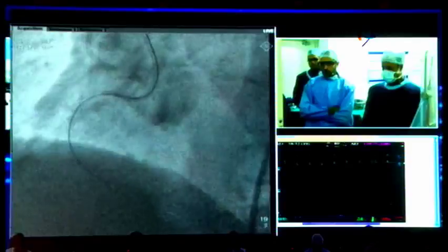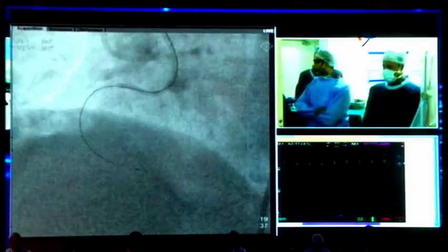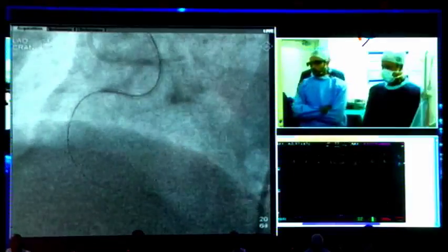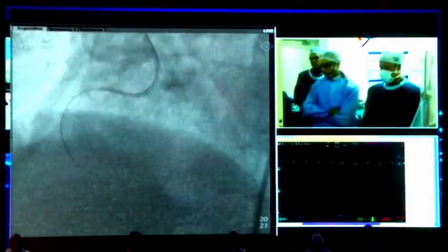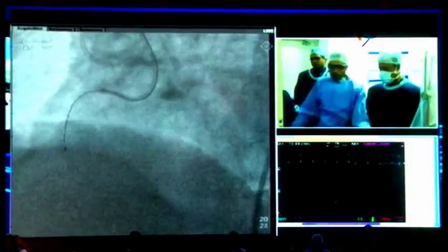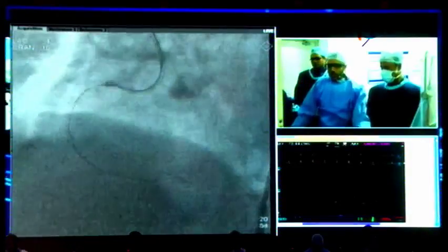Okay. Is that where we are? Is that the last fluoro? Okay, good. So that's where we are. Now we're going to put in a low profile balloon and dilate into that, and then see what we did. So we're going to take pictures now. We have bled back. So for the audience, and I'm sure the panelists know it, but anytime you trap something, please make sure.